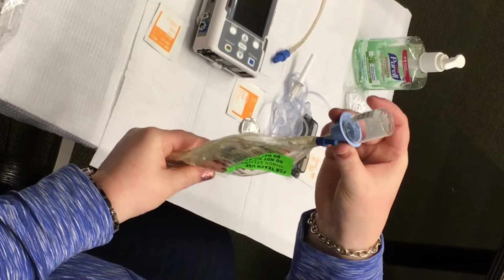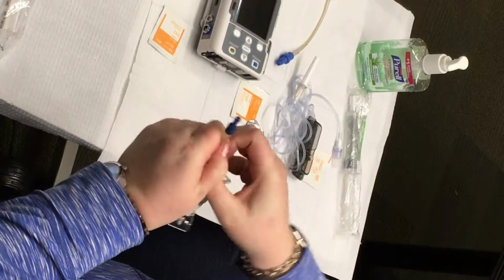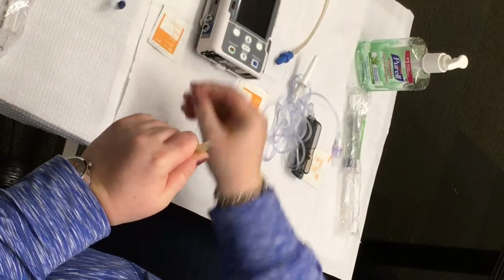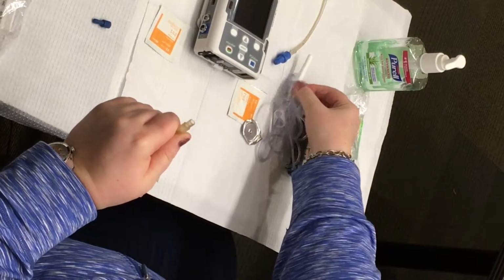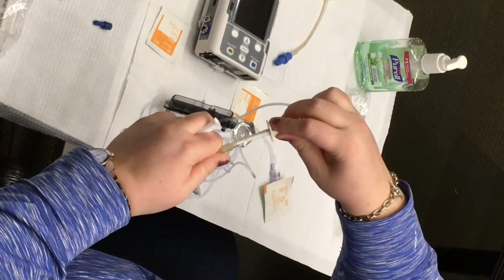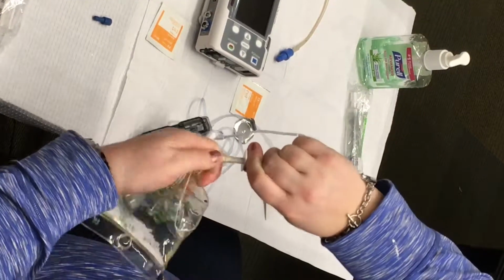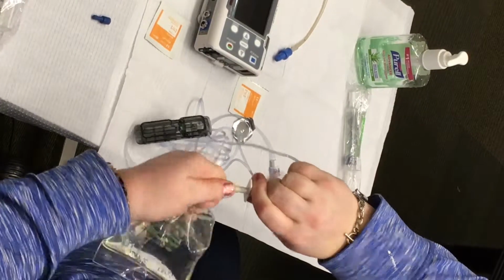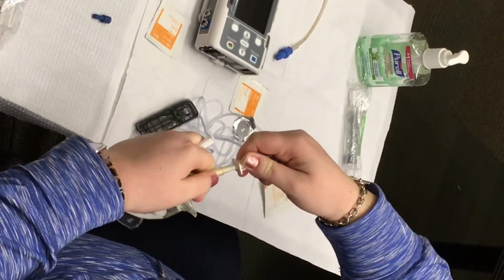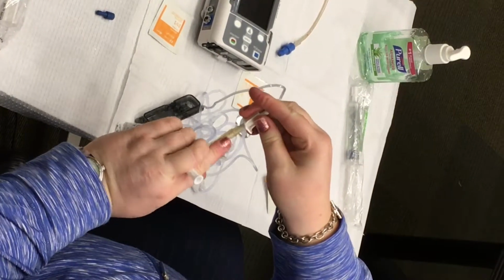Remove the protective cover from the administration port and push the spike of the tubing into the port of the medication bag. Twist and push the spike until it's completely into the port. Make sure your fingers do not touch the spike or the port as it enters the medication bag.